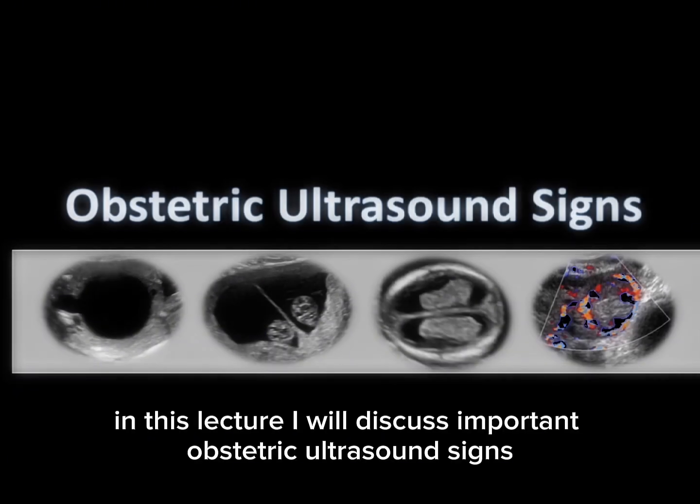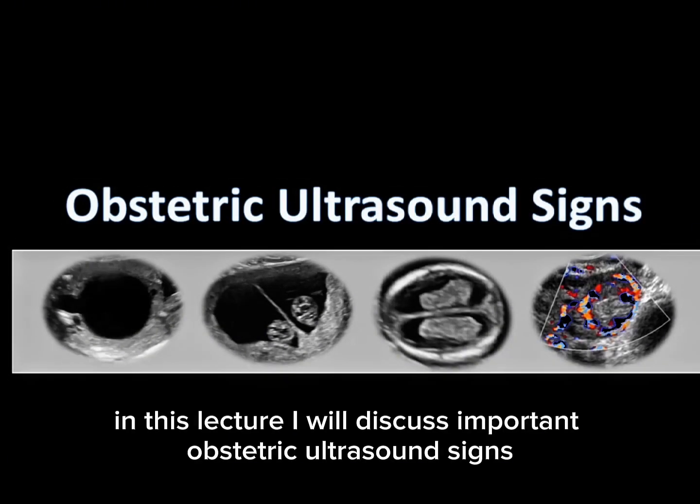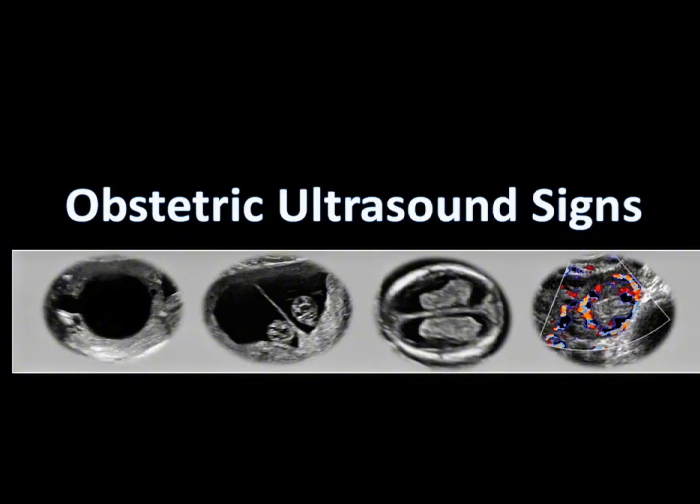In this lecture, I will discuss important obstetric ultrasound signs. So let's start.